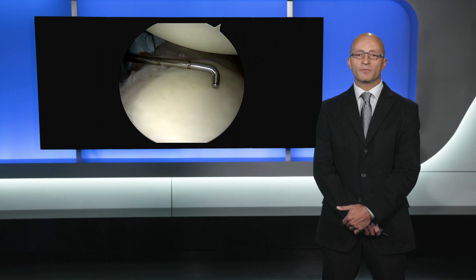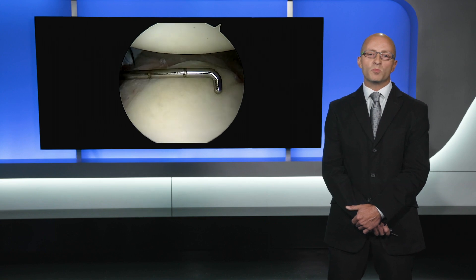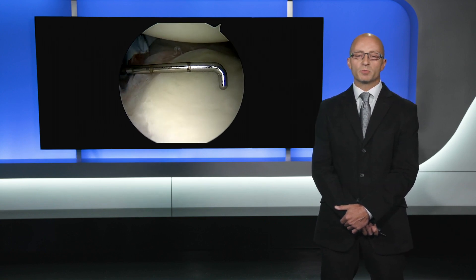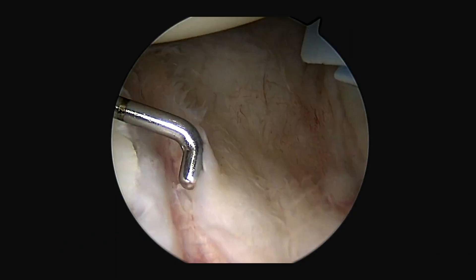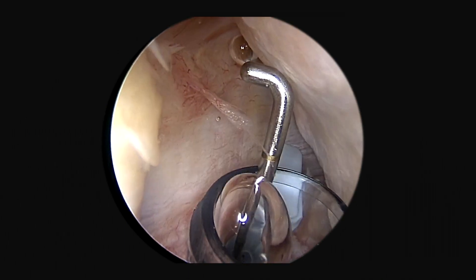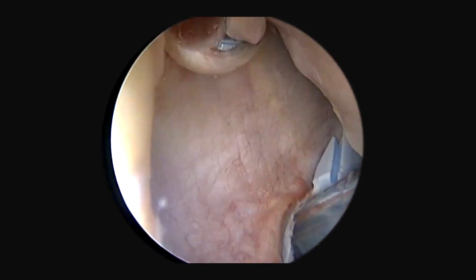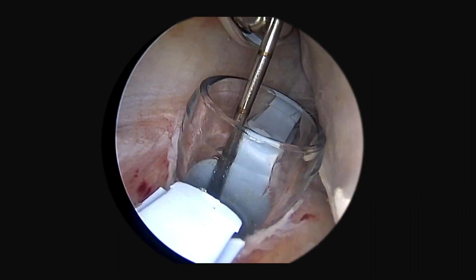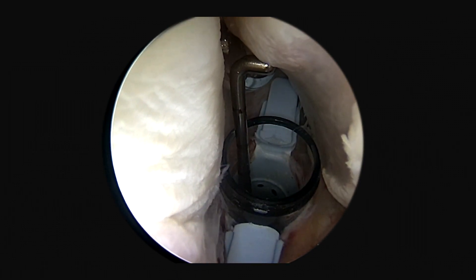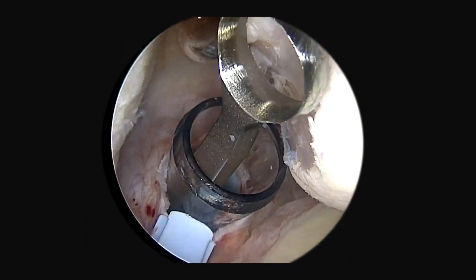Moving to an ASL portal, I'm going to calculate his glenoid width. I estimate his glenoid width at about 12 millimeters posteriorly, so the projected overall width should be about 24 millimeters, with approximately 3 millimeters of bone loss anteriorly. I'm now going to calculate his Hill-Sax interval, which we're estimating at about 15 to 18 millimeters. So we have a borderline lesion, but based on his age and activity level, I think it's best to do a remplissage given his higher risk of recurrence.